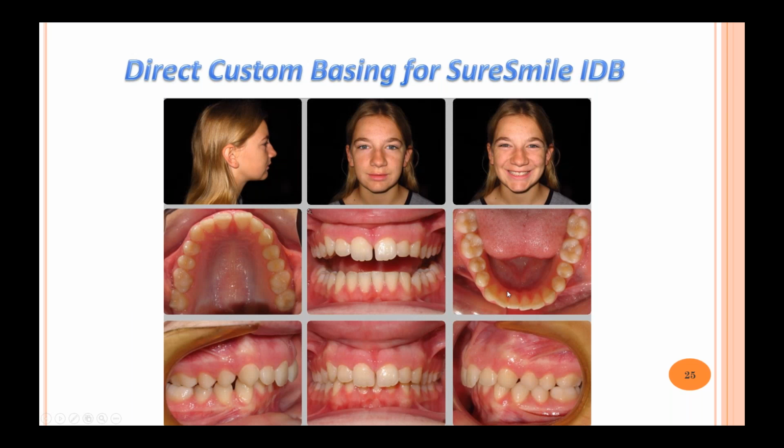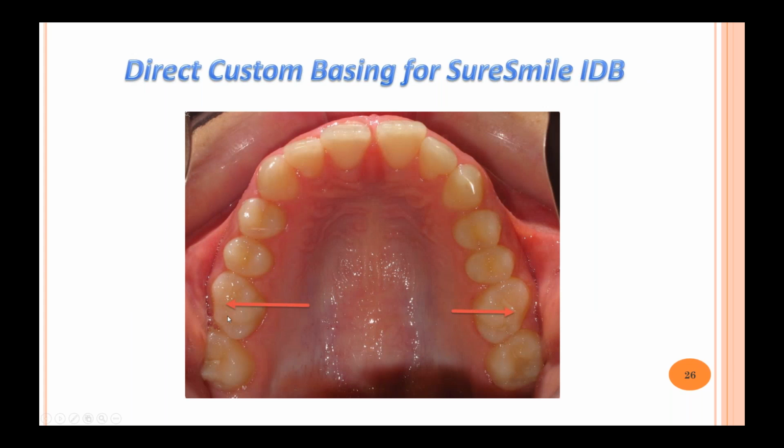All right. Now I'm going to talk to you about a little different concept which I've thought about since we've been doing the SureSmile indirect bonding system, which is direct custom basing, because we no longer need to do that indirect bonding anymore. This is living in the digital world. So what I want to focus on here are this young lady's upper sixes. She's got kind of a rhomboidal, oblique crown anatomy here. And where do you put this bracket? Because if I put the bracket right here, it's going to rotate things. So how do I figure out exactly where this is going to move the tooth to? I think these are all things that we think about as we're placing brackets, whether it's directly or indirectly.